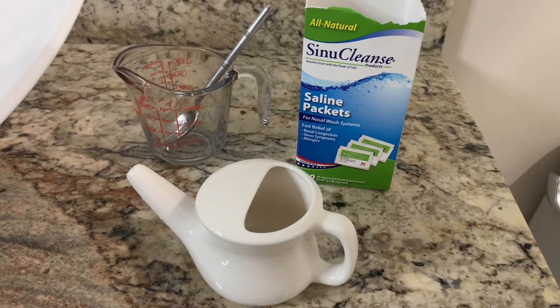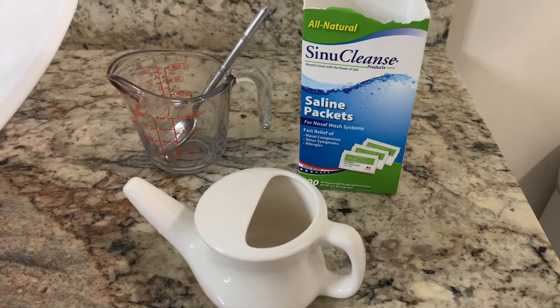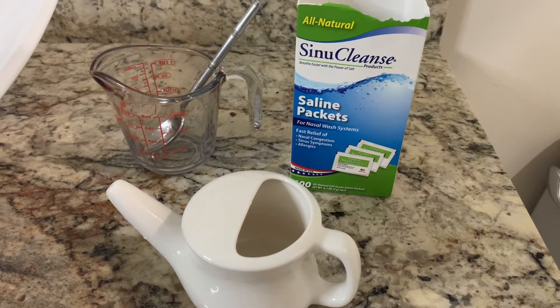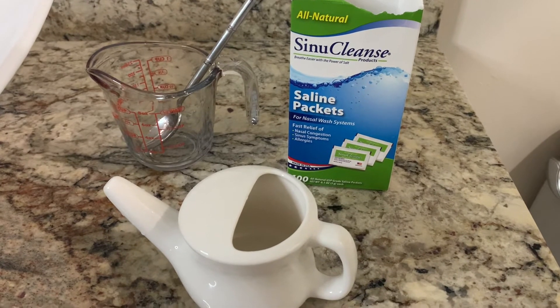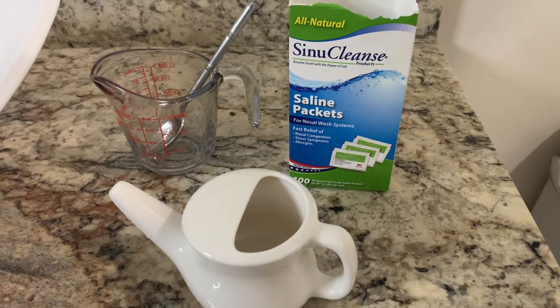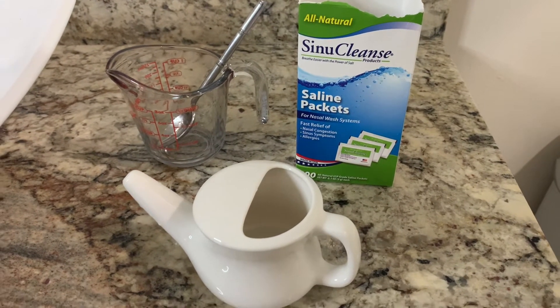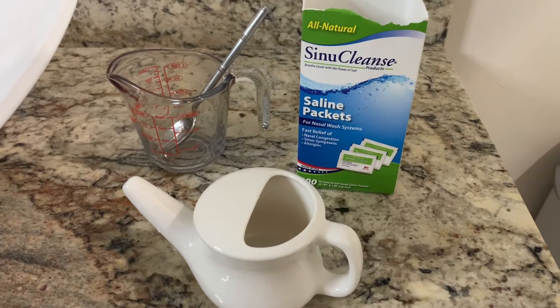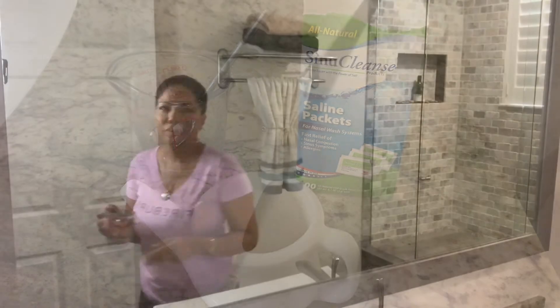These are the items that I use: my neti pot, a measuring cup so that I know that I have eight ounces, my SinuCleanse — which is very easy to purchase online or at a pharmacy — and of course some Kleenex, tissue, or a handkerchief to blow your nose after.